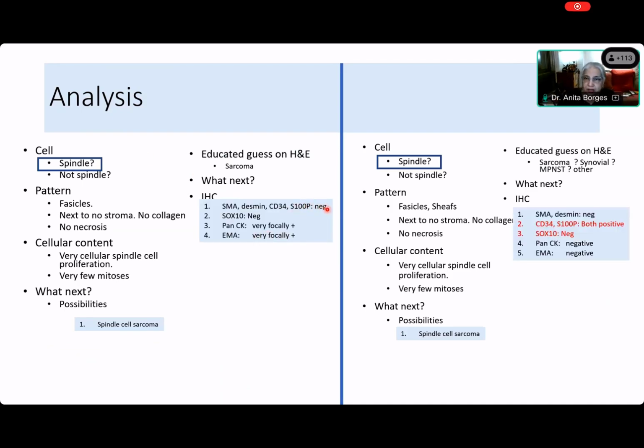And they were all negative. Okay, let's do 5A first. SOX10 was negative, but PAN-CK was focally positive and the EMA was focally positive. Okay, on the other hand, on 5B, SMA and Desmin negative.